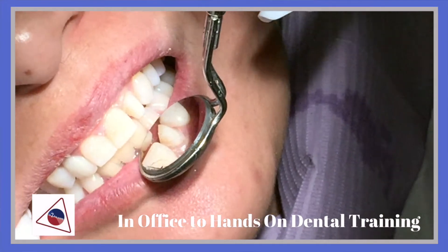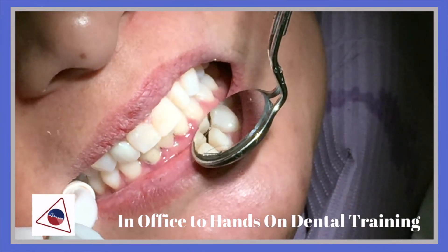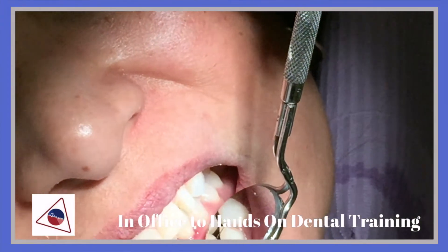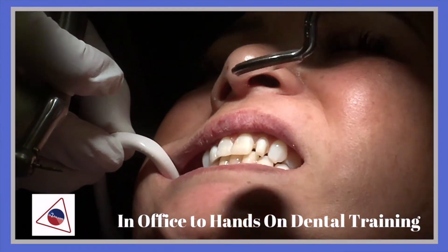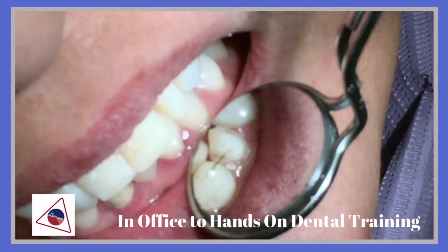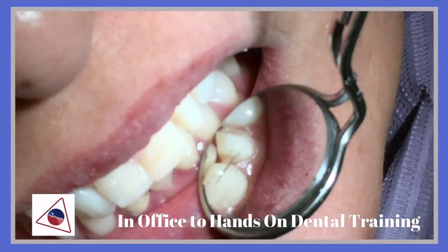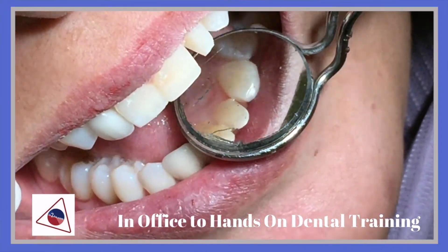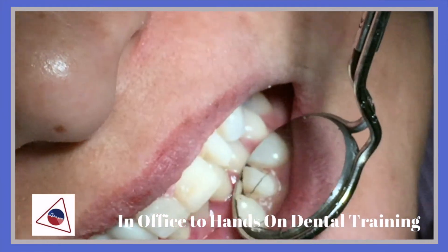Now bite down. We're going to be checking the occlusal clearance of tooth number 10. And if you look at that, she doesn't even touch. You could see in the mirror — you have to bite down all the way to make sure I have enough clearance. When I look at the mirror, you want to make sure I have enough clearance for the porcelain or the metal lingual surface on a crown prep.